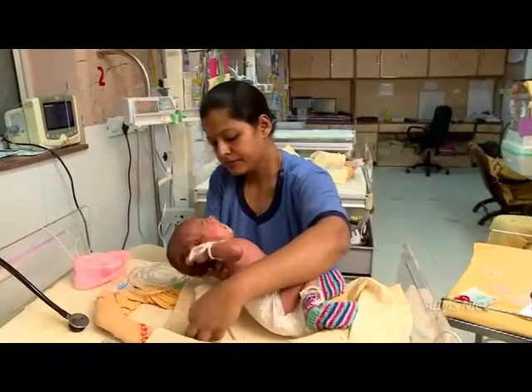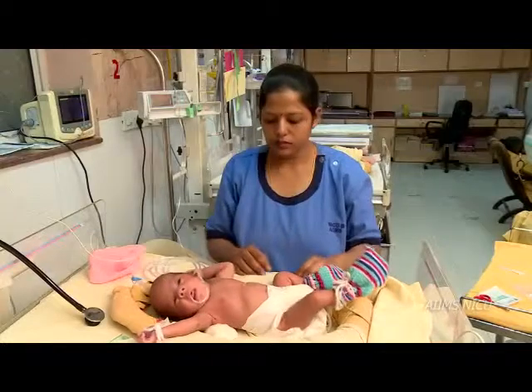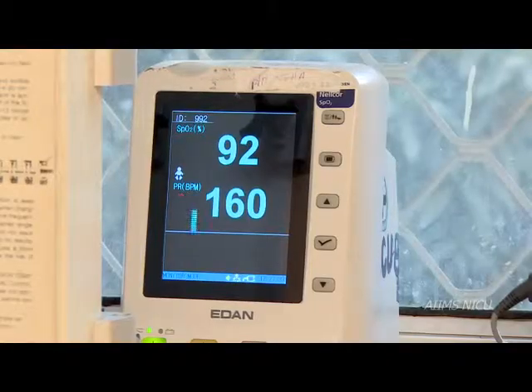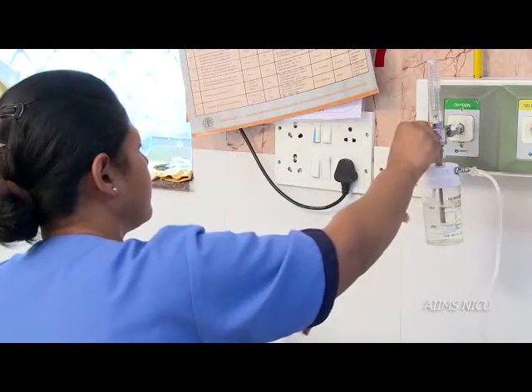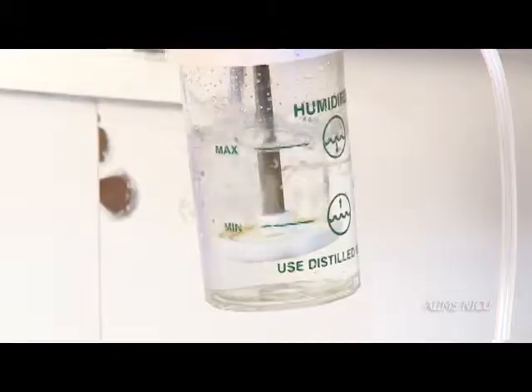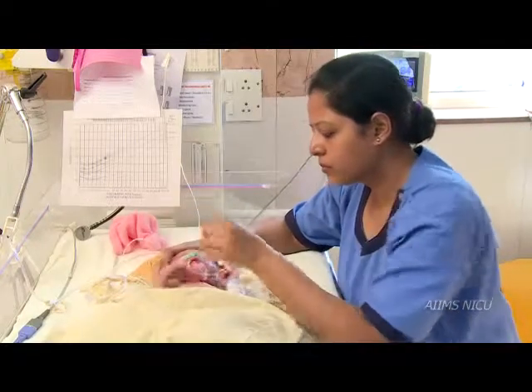Ensure that the infant is nursed in supine position and the neck is slightly extended to maintain the patency of the upper airway. Remember that the monitoring is not restricted to the infant alone, but also includes periodic check of the oxygen source, flow rate, level of distilled water in the humidifier chamber, and the position of the nasal cannula.